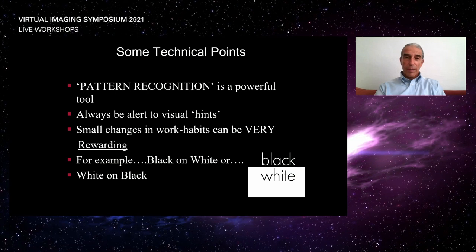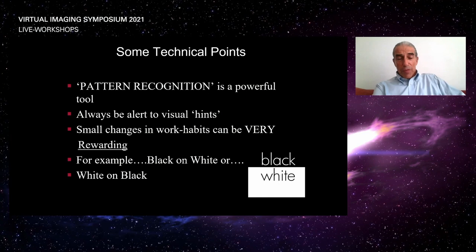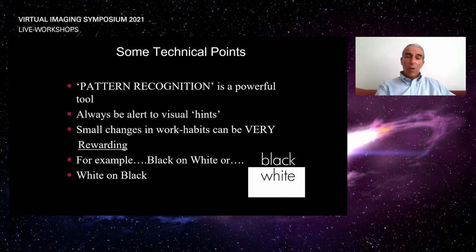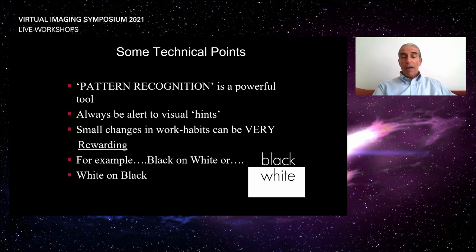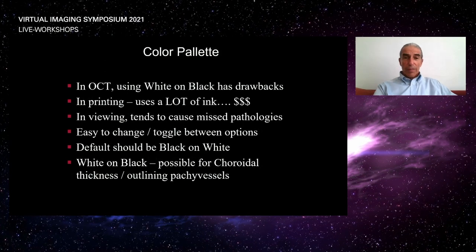The third point I'd like to share with you is what color coding we use for our scans. Now, it's a question that's been around for many years. Do we use OCT black on white or white on black? I have always been using black on a white background for many reasons.